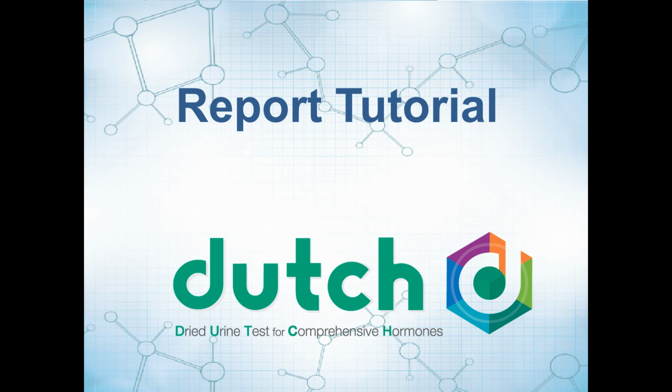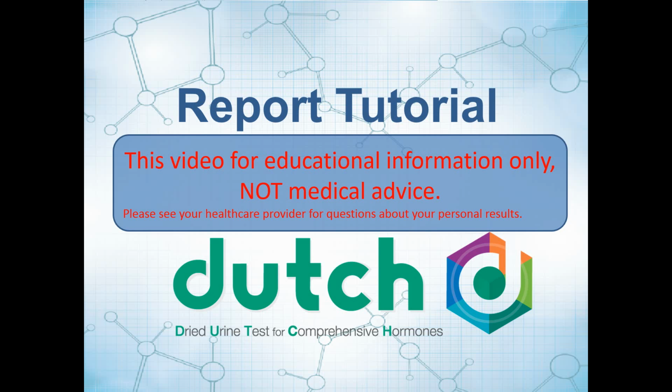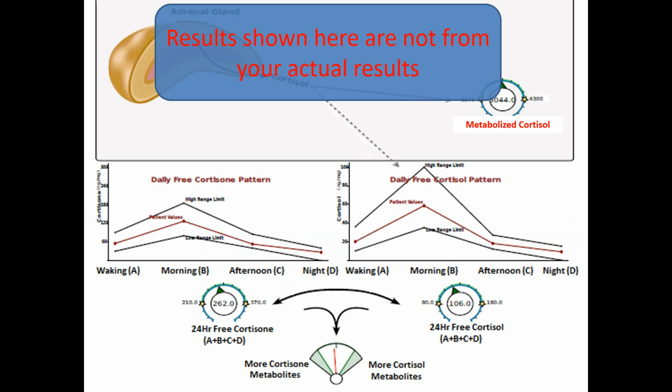This is a Dutch testing report tutorial to assist with the interpretation of results. This is for educational information only and not to be taken as medical advice. Please do note also that the results that we're showing on the screen are not from your actual patient here, although we will discuss some of the generalities of the results that you may have.